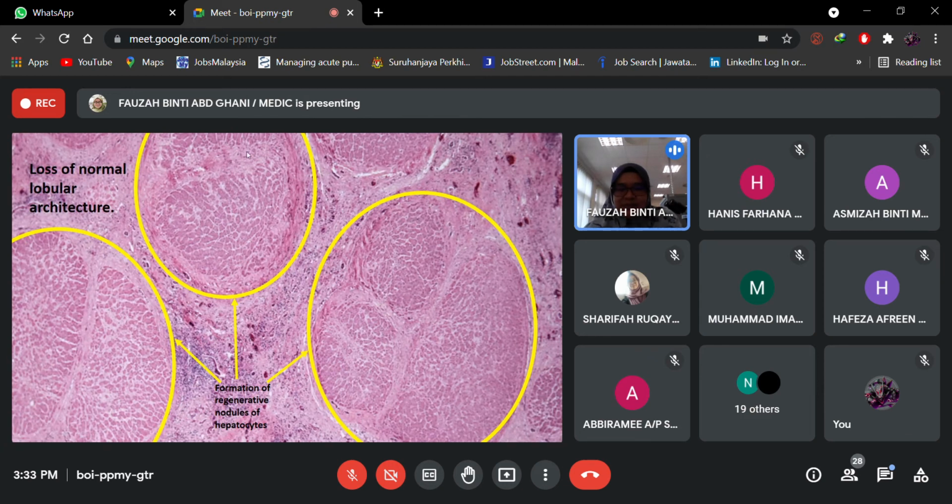So the hepatocytes, if we look at the normal histology earlier, should be widespread hepatocytes without any intervening fibrosis. It's just full of hepatocytes, and you see portal tracts and central vein in a very organized manner, but not in this condition. Okay, so the hepatocytes are in nodules, and they have these blue things in between the nodules of hepatocytes.